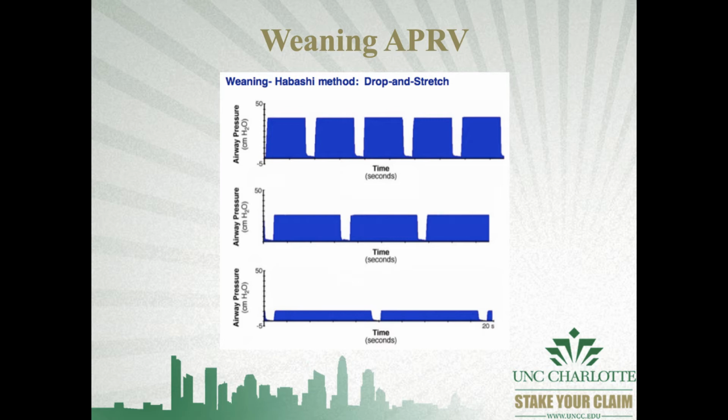I think APRV is a lot more appropriate for trauma patients. That's just from my experience and a lot of research I've delved into. Some people think it works well in ARDS. I absolutely do not think so. But it could boil down to clinician experience, facility experience, the different patients individually.